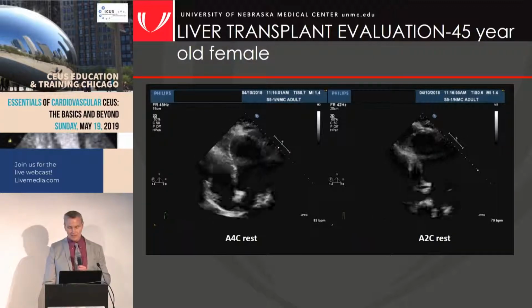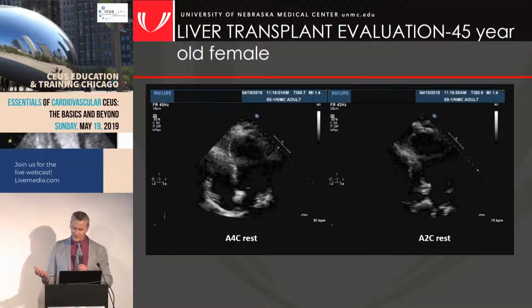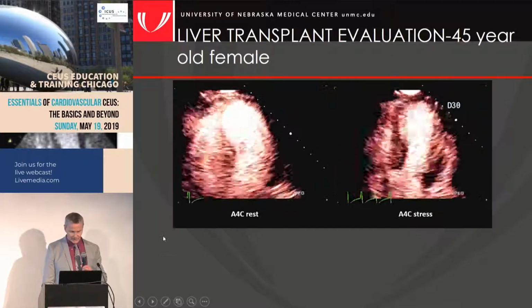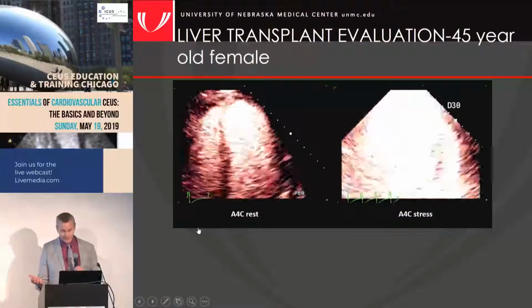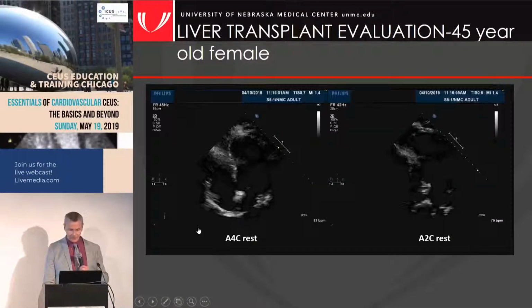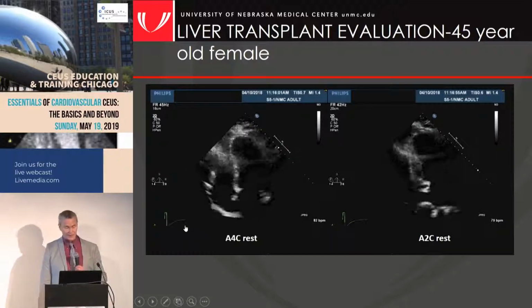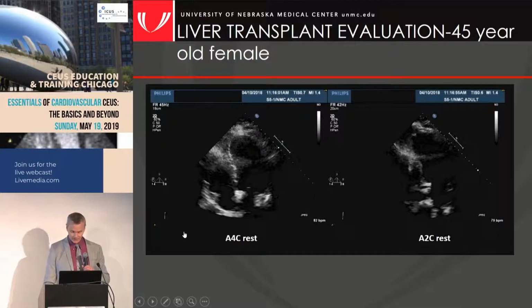We get almost all of our liver transplant evaluations, no matter what their risk factor profile, they tend to come for stress echoes. And you say, well, that seems kind of stupid. And we think it is a lot of times because they have so few risk factors. But occasionally we see a case like this, and we say, well, maybe we should be doing that. This was that patient I just showed you. She had tough windows, 45-year-old, alcoholic cirrhosis, and they wanted a stress echo. And we stopped arguing with them. We just go ahead and do them.